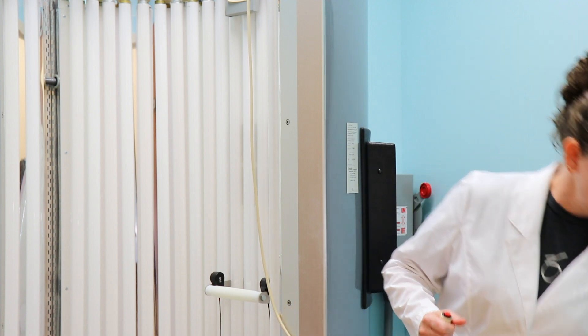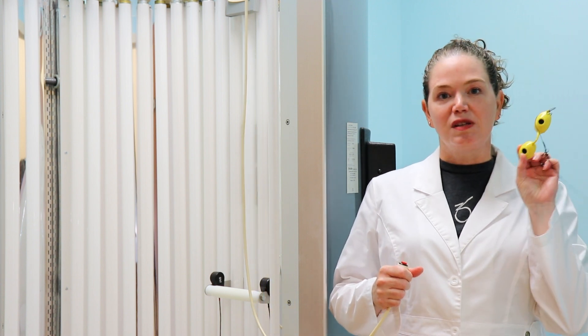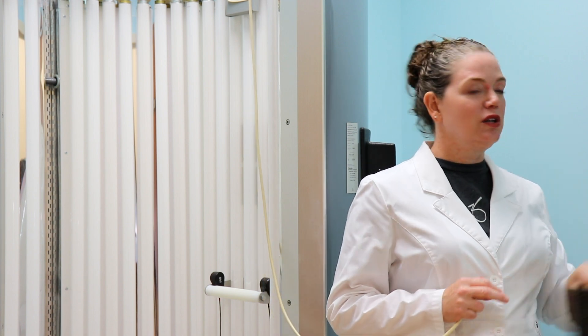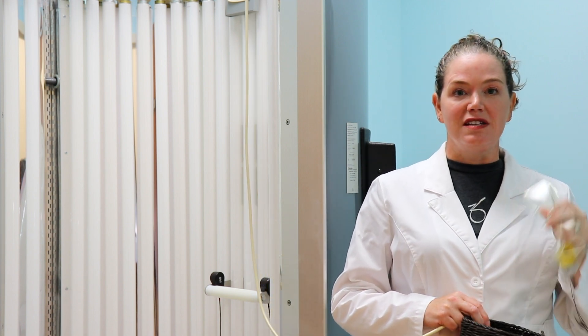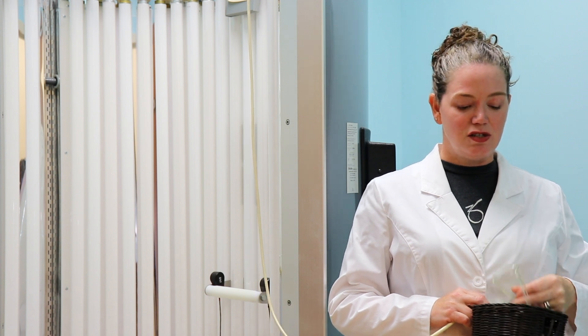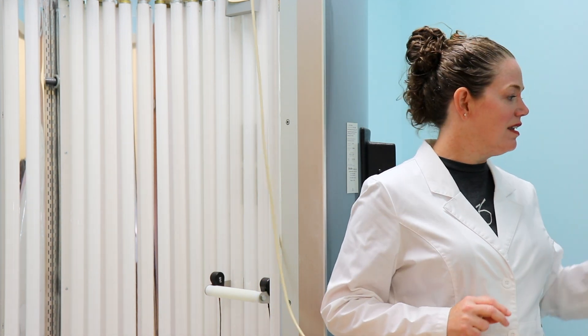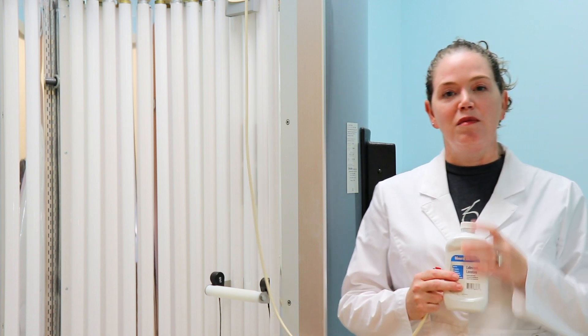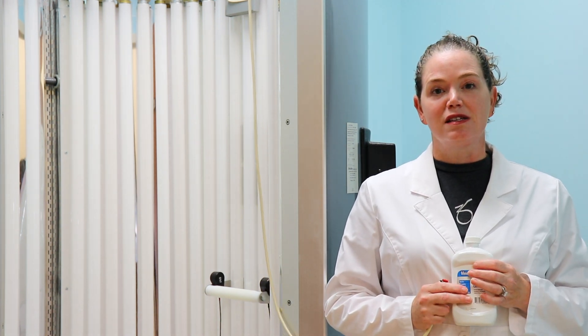Important details before you get started: we do have goggles. I have some little ones and then also bigger ones that can go across your eyes a little bit more to protect your eyes from the light. So you do want to protect your eyes while you're in the light booth, and then we also have mineral oil that can be dabbed on the spot.